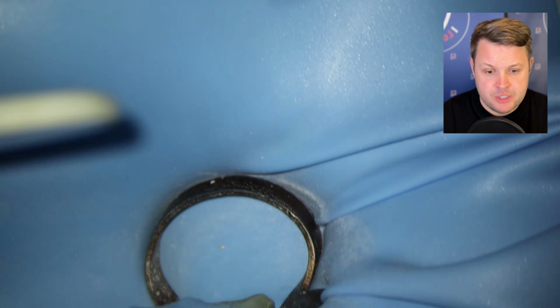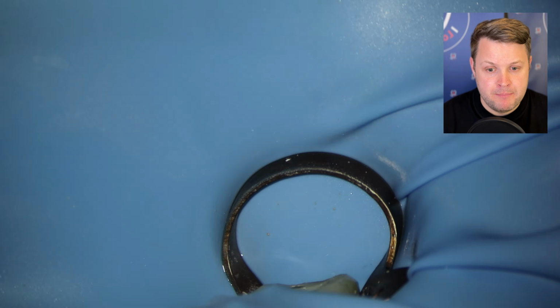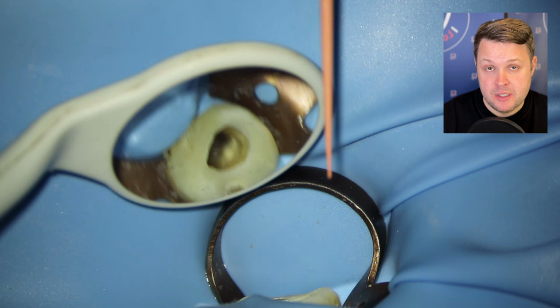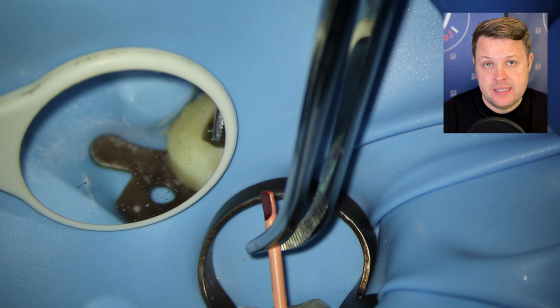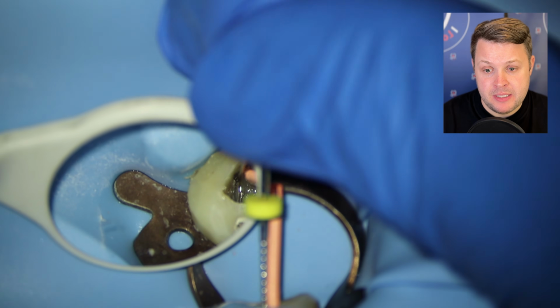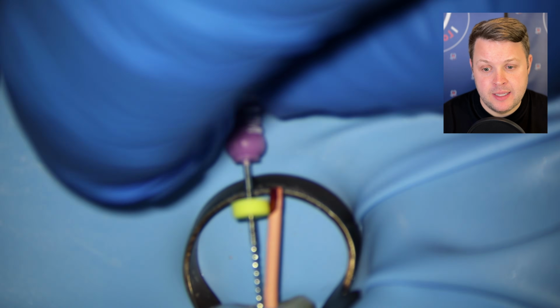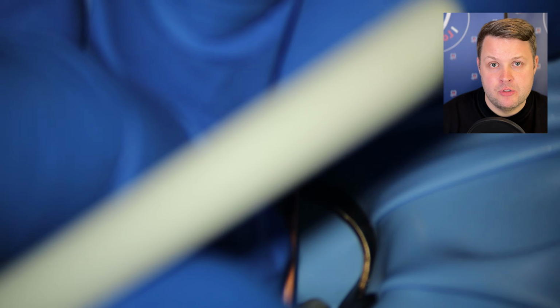I'm going to do a bit of irrigation. At this point I'm suspecting the MB1 and the MB2 join, because when I irrigate and aspirate, both canals irrigate and aspirate at the same time. So just to check this confluence, I'm going to take a GP point and place this to length in the MB canal, and then I'm going to place a hand file in the MB2 canal. I am then going to very, very gently push this hand file to length, and as I push it down the canal, I feel a kind of spongy feeling, and that's the tip of the file touching the GP cone.